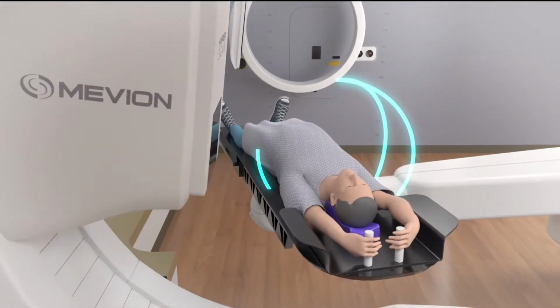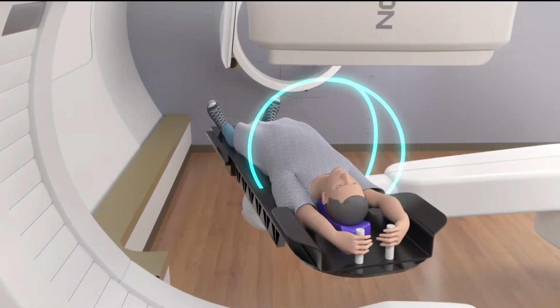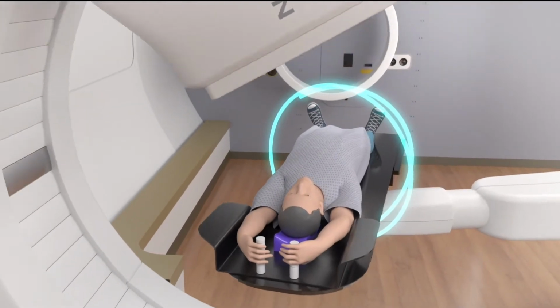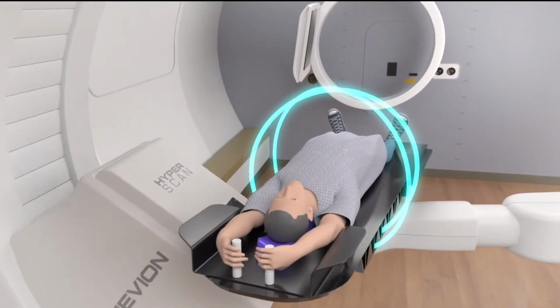Proton therapy differs from traditional X-ray therapy. So when patients hear radiation therapy, they're typically thinking about X-ray therapy. Proton therapy uses protons instead of X-rays. And protons have charge, they're positively charged, and they have mass. And so we can use those physical attributes to control how deep protons go into patients' tissues. So rather than treating the tumor and the X-rays continue to pass through, we can stop protons at the appropriate depth. And that helps us treat the tumor, but spare radiation to the normal surrounding healthy tissues.